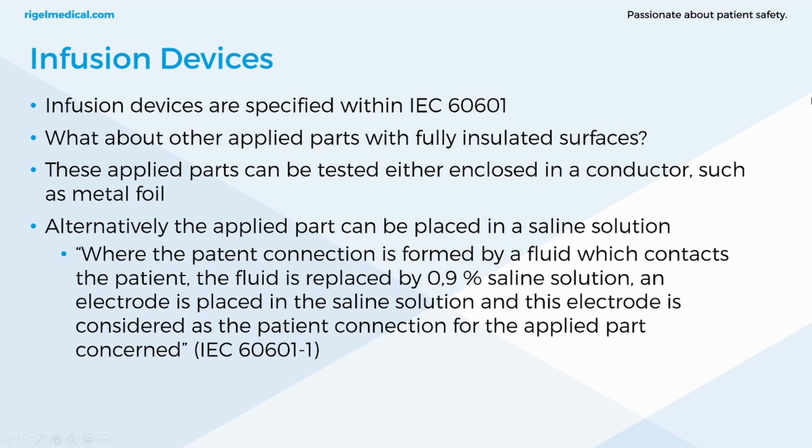You can either encase it in metal foil, that gives you a conductive surface. I've seen biomed engineers use this for cuffs, BP cuffs, SpO2 probes, etc. And this, of course, was used in the penultimate example with ultrasound, whereby saline solution is used in exactly what's recommended here. And although we got that from an ultrasound manufacturer, that is the correct method of testing according to the IEC internationally accepted standards.